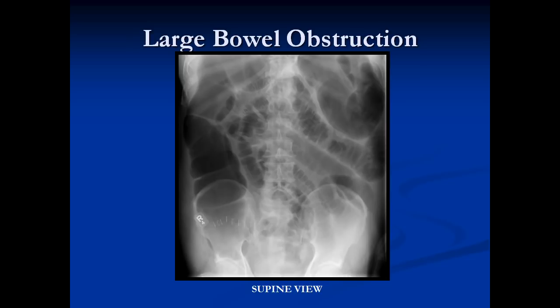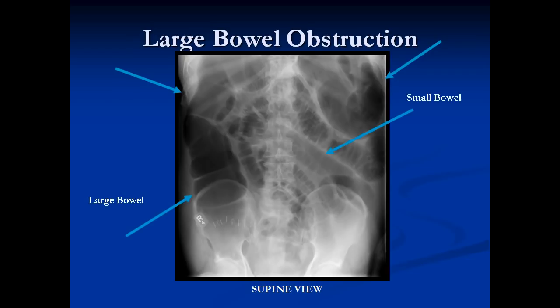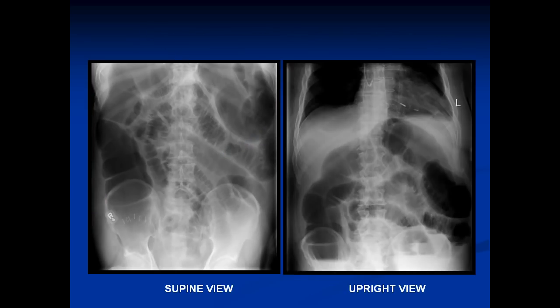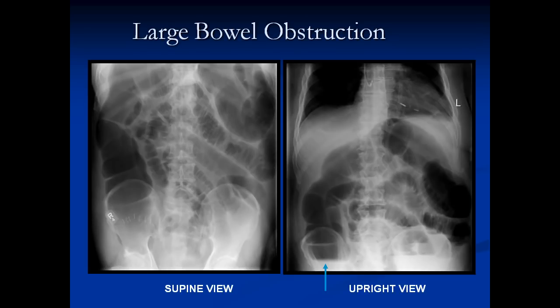Here's a large bowel obstruction — lots of distension of loops of small and large bowel all the way around, but no air in the rectum or descending colon, so the obstruction is probably at the splenic flexure. We can identify large bowel because the haustra go only partway across, while small bowel plica semicircularis go all the way around. Large bowel forms the window frame around the outside, with small bowel in the center. On the upright view, we see air-fluid levels in both the large bowel and the small bowel.